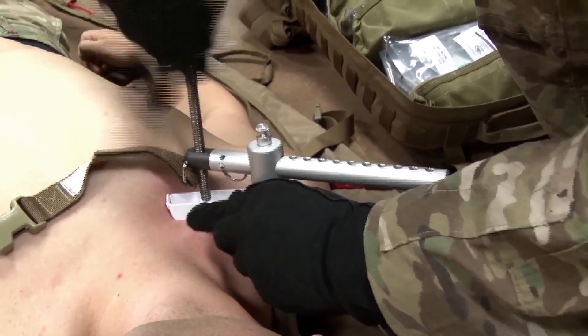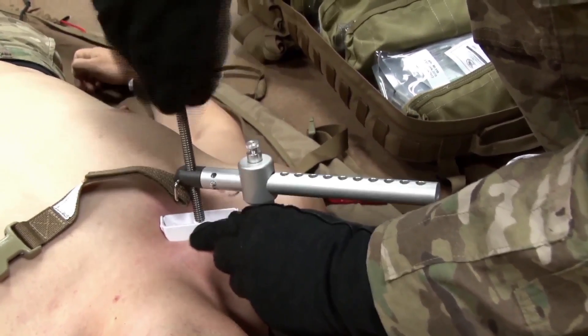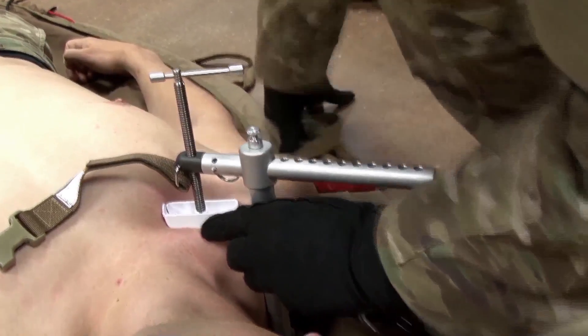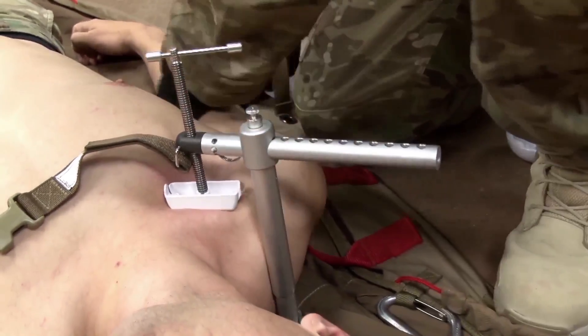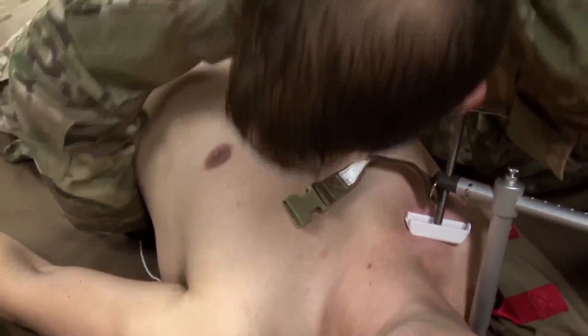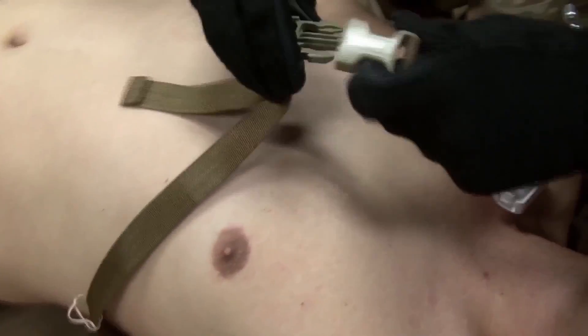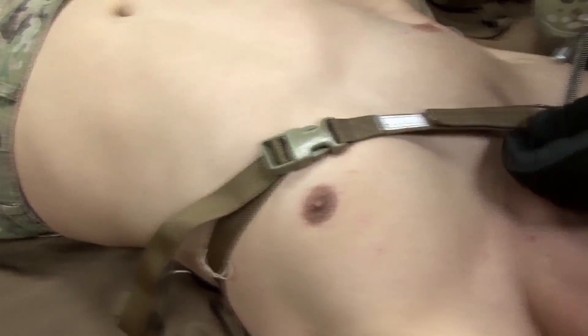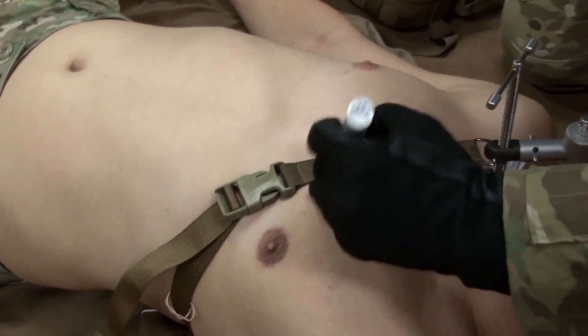The pressure disc should not contact the clavicle. Apply pressure by turning the T-handle clockwise. Apply pressure until the bleeding stops. If hemostasis is not achieved within 20 full turns of the device, consider releasing and repositioning the pressure disc. Route the securing strap underneath the uninjured arm and attach the clasp. Write the time of application on the label.